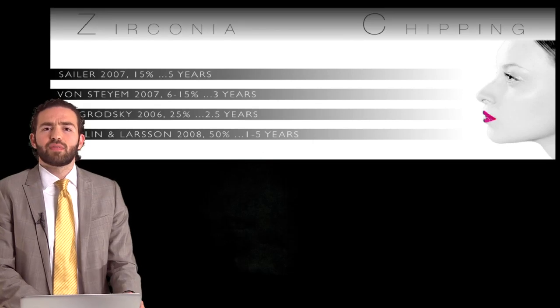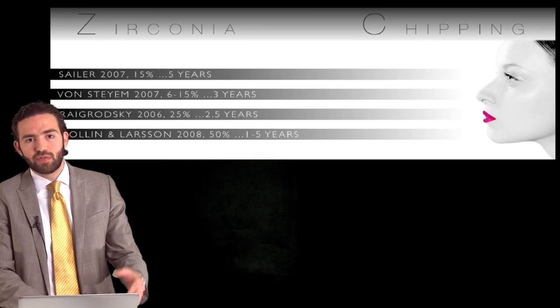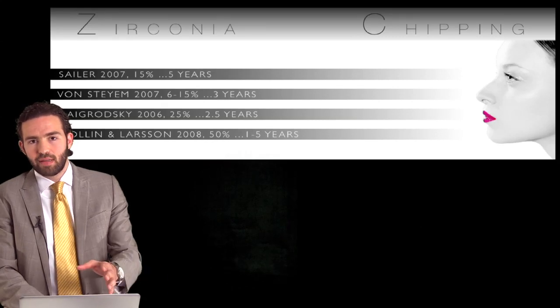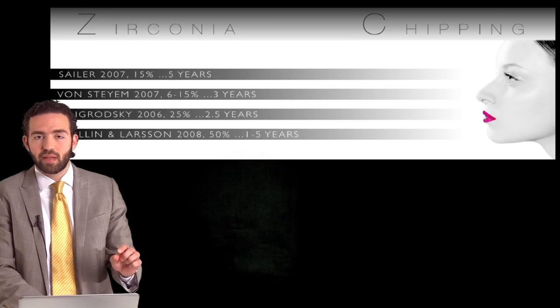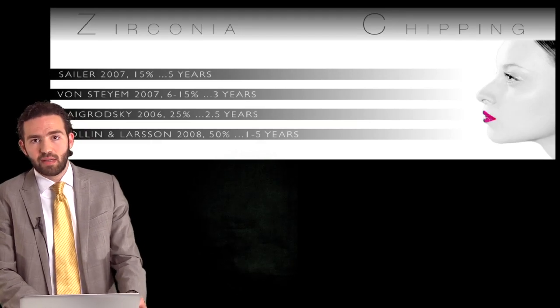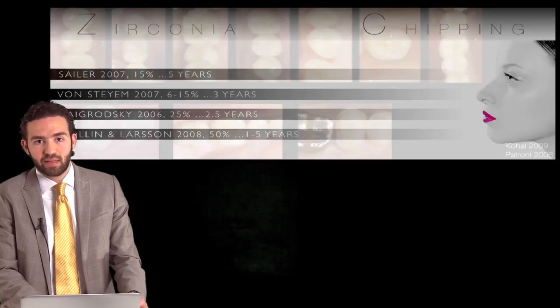What about the issue of chipping of zirconia? We looked over the literature that has been published over the last 10 years, and the main pattern that has been published about zirconia is really the chipping of these restorations. You see on some of those clinical trials, 50% rate of chipping over 5 years. That is unacceptable on a daily practice.